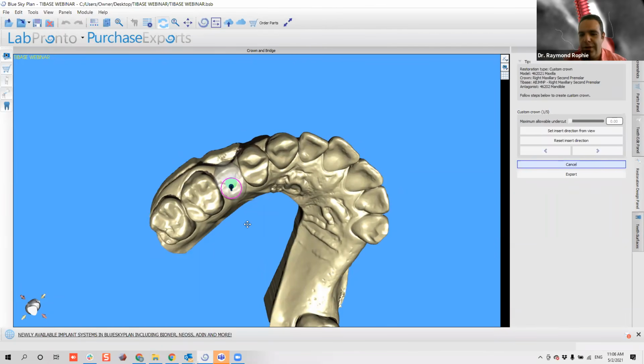However, the fact that you can have the surgical guide and the custom healing abutment, the temporary and the models before you even touch the patient, that's something that was not easy to reach a few years ago, right? So now, showing these capabilities, you can totally explode and improve everything that you know clinically.